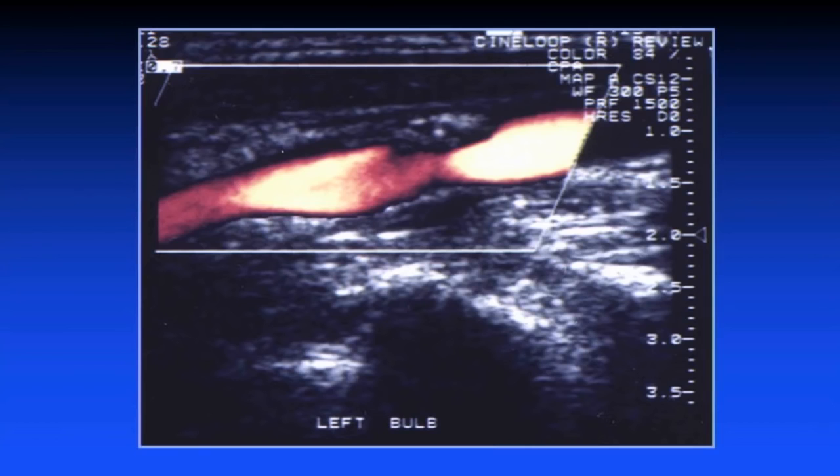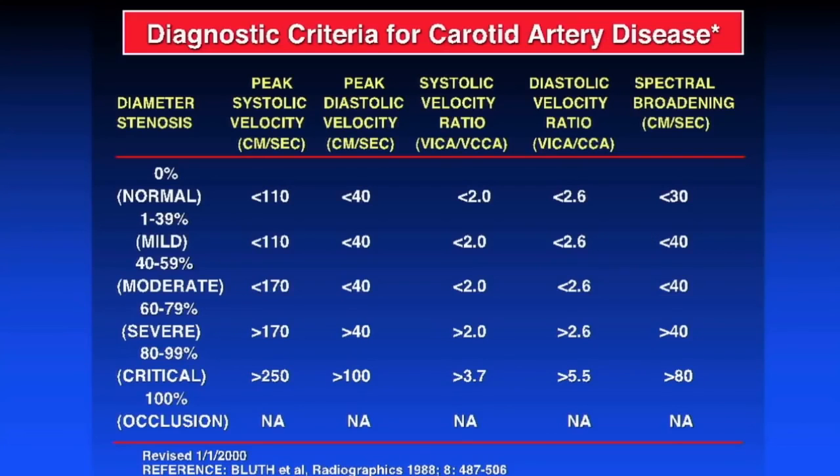And I think we're going to have to go back and really deal with that more effectively than just saying that plaque exists and the degree of stenosis is something else. We need to characterize that plaque. We need to identify the issue of who's at risk of vulnerable plaque.